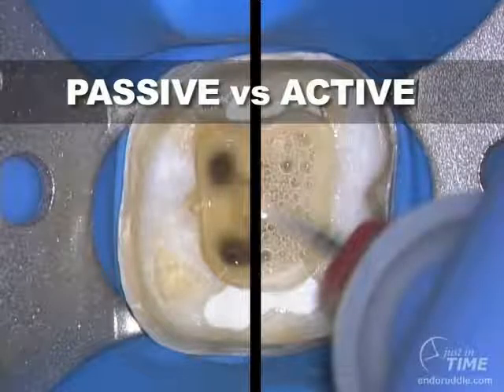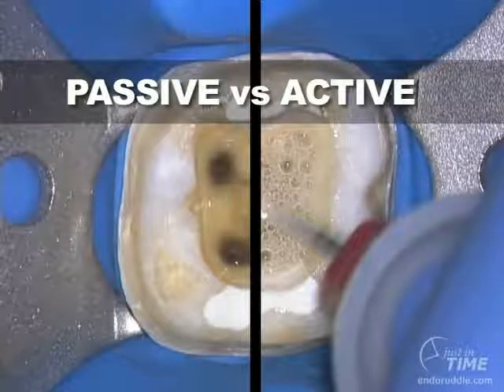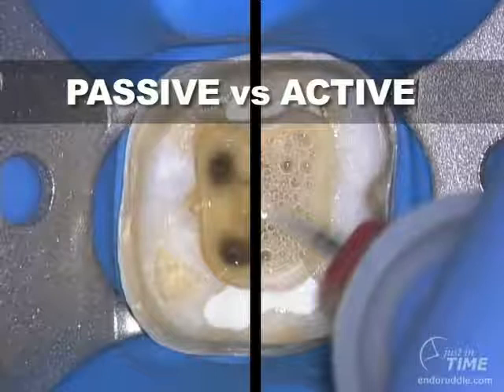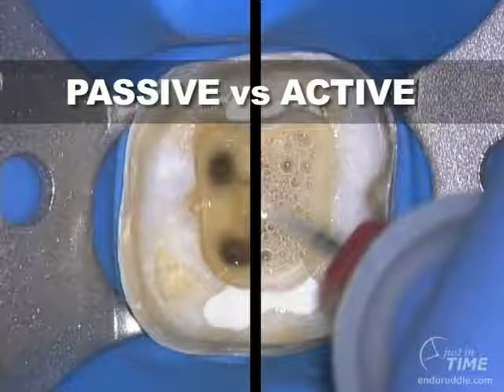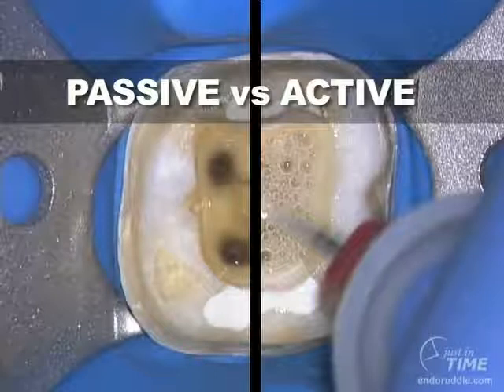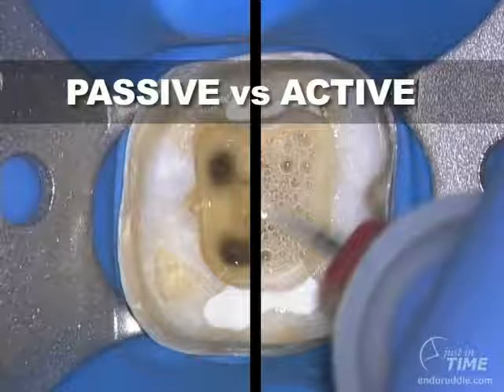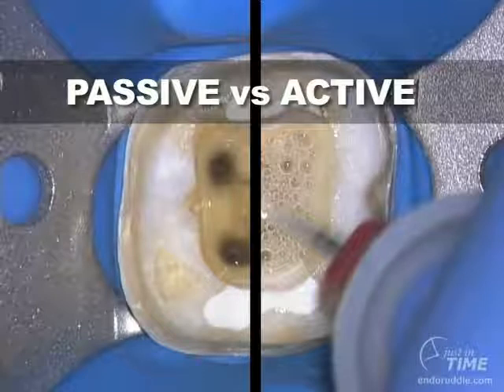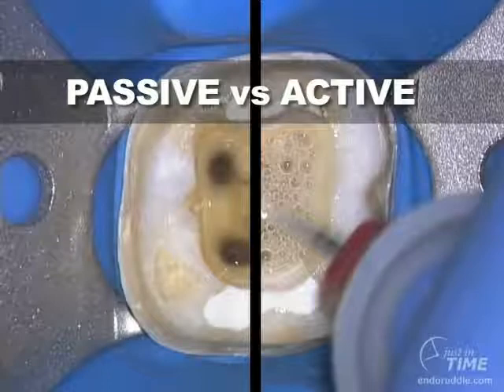There's been tremendous interest internationally in active irrigation, because activating reagents allows them to move into the deep lateral anatomy. Passive irrigation, on the other hand, means the solutions in the tooth just stay still. They're not really moving, and it would take a significantly longer amount of chair time for a passive irrigation method to be complete.